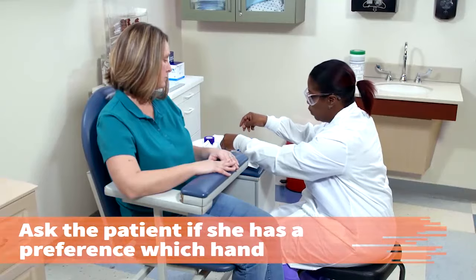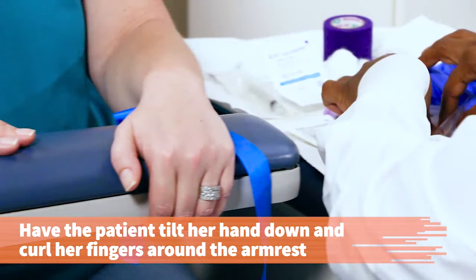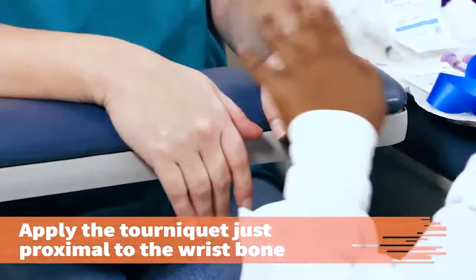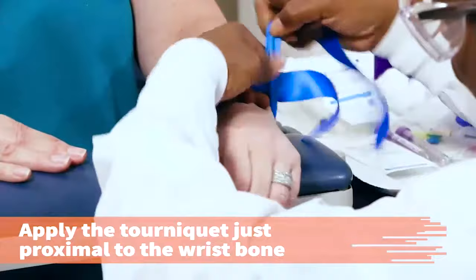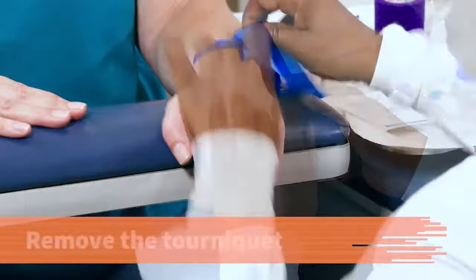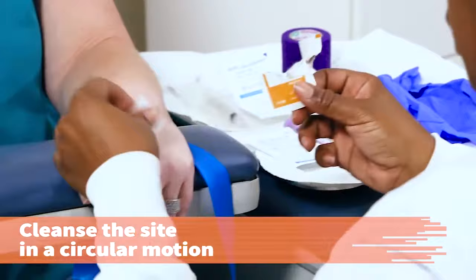Ask the patient if she has a preference which hand is used for the venipuncture. Does it matter which one? No, not really. If drawing from the back of the hand, have the patient tilt her hand down and curl her fingers around the phlebotomy chair. Alternatively, have the patient place her venipuncture hand open over the other fisted hand with the fingers lower than the wrist. Apply the tourniquet around the wrist, just proximal to the wrist bone. Do not apply the tourniquet so tightly that blood flow in the artery is impeded. Select a vein on the back of the hand that is prominent, stable, and straight as possible. Remove the tourniquet and cleanse the site, starting in the center of the area and working outward in a circular pattern with the alcohol pad.